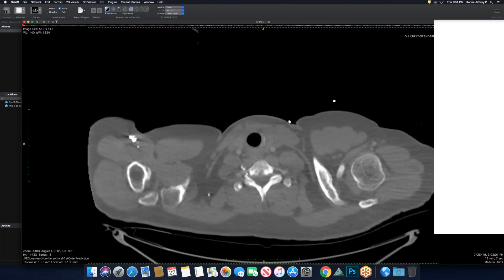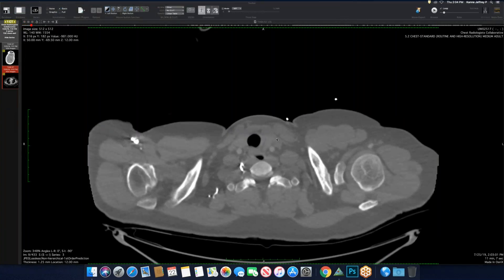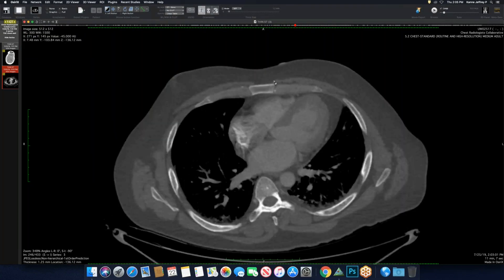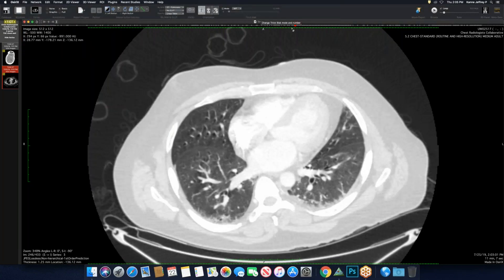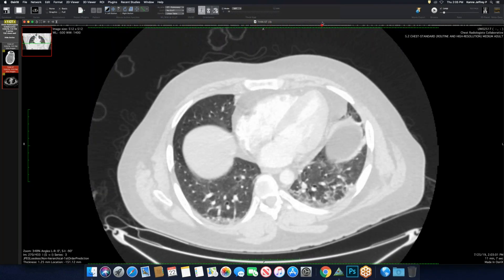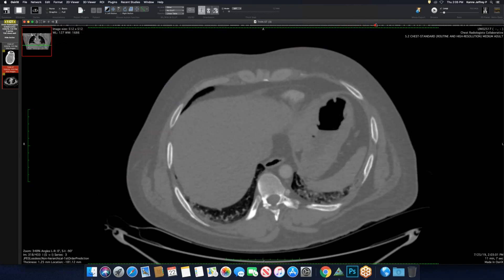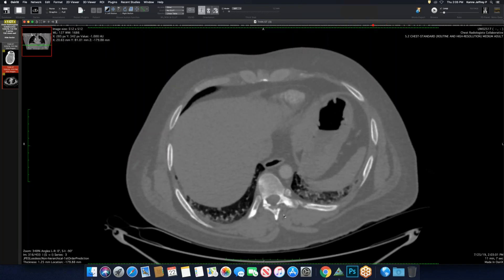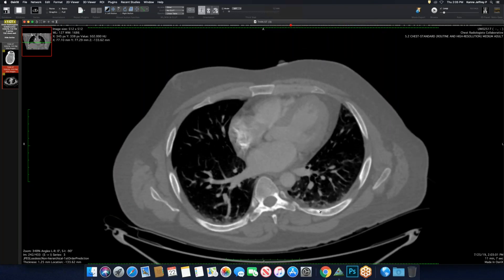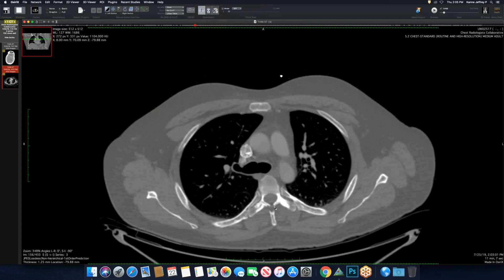Let's start with this case. I've been waiting to show this case. This is a male patient with tuberous sclerosis, and we were asked to exclude lung involvement. We might be looking for a LAM or something, and there's really nothing in the lungs to get excited about. But we do have a good example of the bones. One of the findings described in tuberous sclerosis is sclerotic foci, and it seems to be confined to the posterior elements of the spine, a few in the ribs posteriorly, maybe a few in the sternum — just very striking diffuse bone involvement.